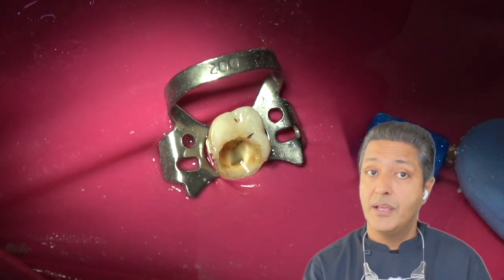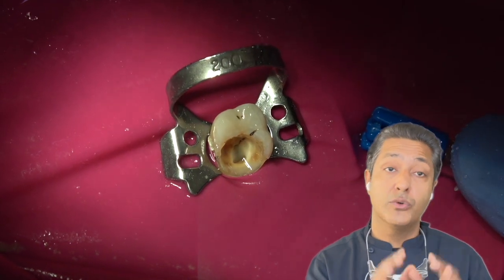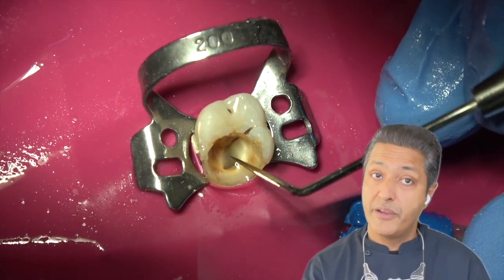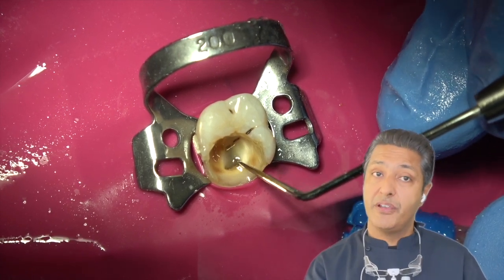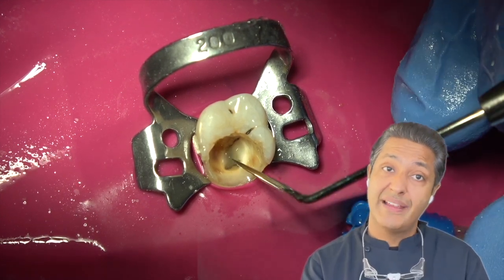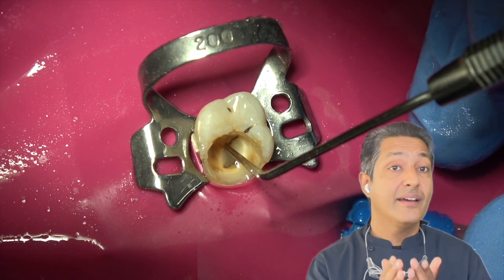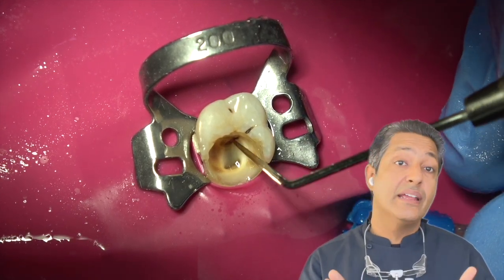So use a DG16 explorer or an endodontic explorer, both are the same explorers. Use this instrument to examine the peripheral extent of the pulp chamber. If we feel that we have decently extended the pulp chamber, at this point of time, we can go for location of the canals and see if we have orifices with us. However, if we find all the orifices, that does not necessarily mean that we have performed an ideal access cavity.